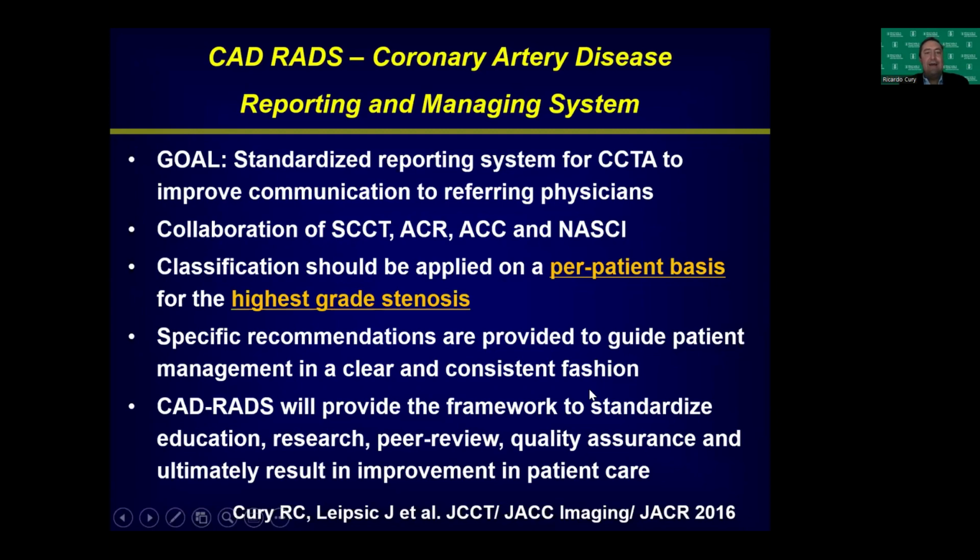The classification should be applied on a per-patient basis for the highest grade stenosis, and specific recommendations are provided to guide patient management in a clear and consistent fashion.